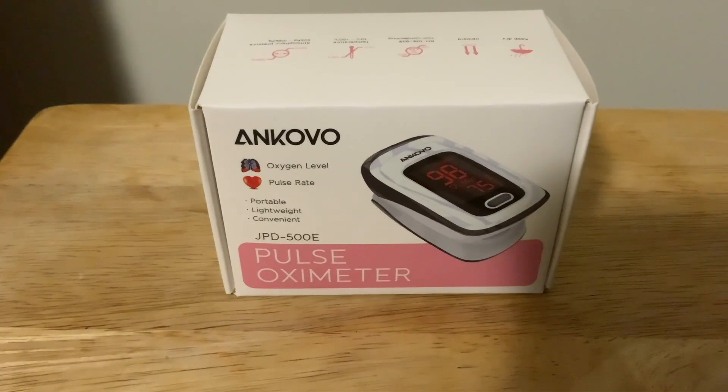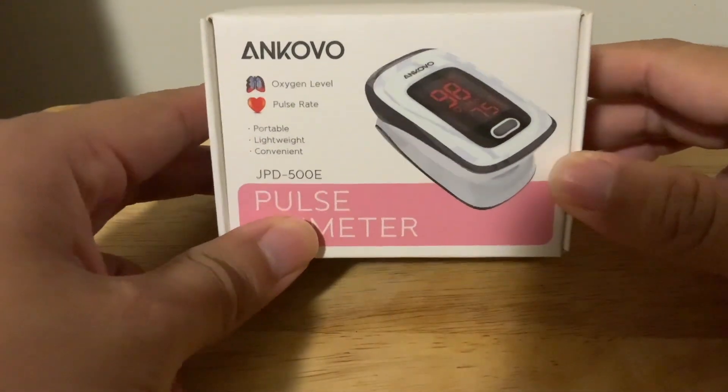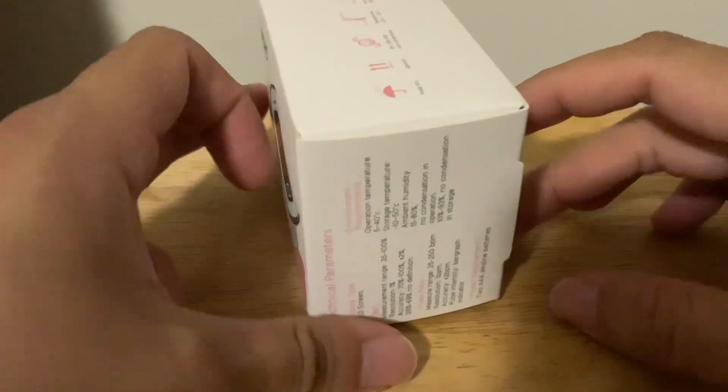Hello guys, today I'll be unboxing the Ankovo JPD-500E Pulse Oximeter. I got this off of Amazon — it's to measure your oxygen level and your pulse rate.